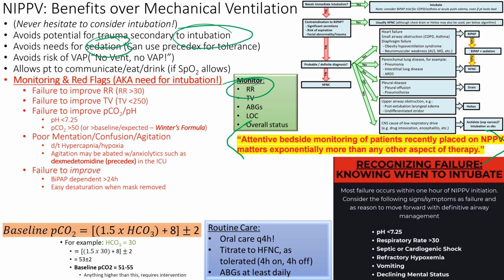Well, respiratory rate, right? If the respiratory rate goes down, they're breathing, there is a backup rate on the BiPAP, but it's not going to be like a ventilator respiratory rate, which can actually control someone's CO2, right? But respiratory rate and tidal volume, you can look at the BiPAP, sorry, and it tells you right then and there what your respiratory rate and your tidal volume are. No longer is the respiratory rate 18, right? Oh shoot, it's 38. That's a really fast respiratory rate, right? And you can see the tidal volume in real time. Oh, they're getting 250, 350, 200. It's like, well, 200, I know that's not that great, right? That's a poor tidal volume. And how do I fix that?